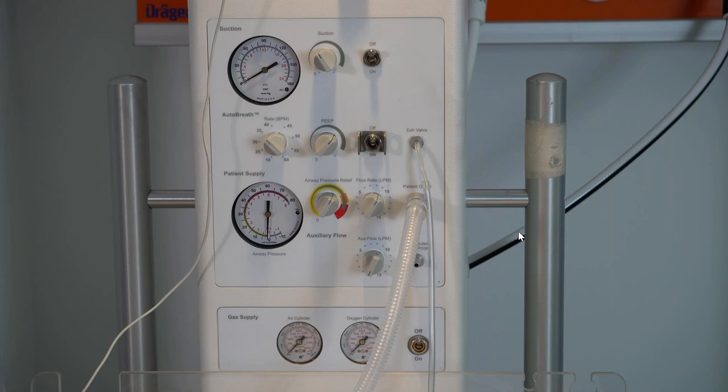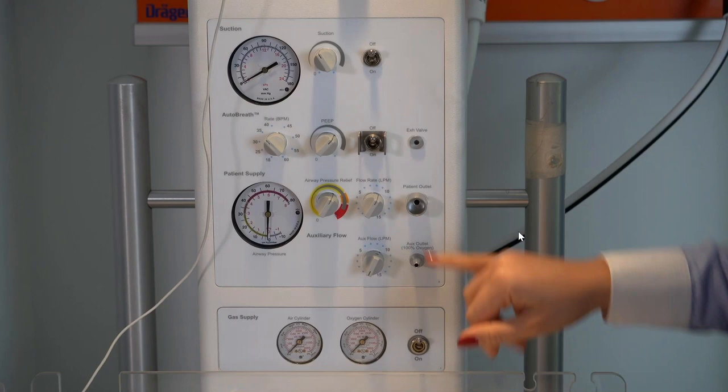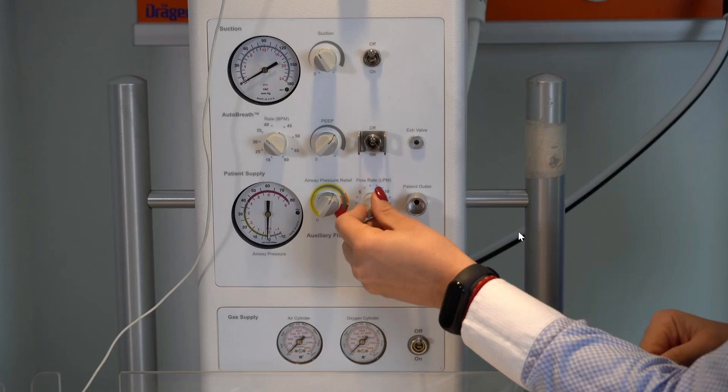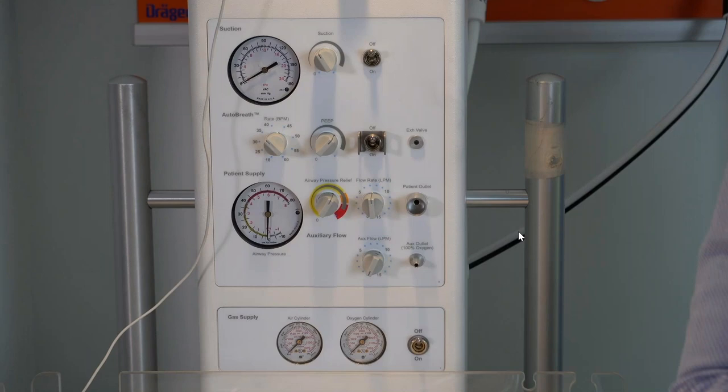Excellent. Thank you. So there are two questions on the resuscitator, which are pretty much the same. Can you explain what the auxiliary flow and the O2 outlet are for, and also the difference between the flow rates in liters per minute and the auxiliary flow in the resuscitator? That's an excellent question. So some of you might have noticed that we have the settings for the patient outlet. Here, for the flow rates, you can control from 0 liters to 15 liters per minute. So this is your normal flow rate in the system.